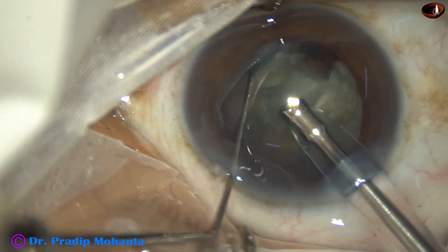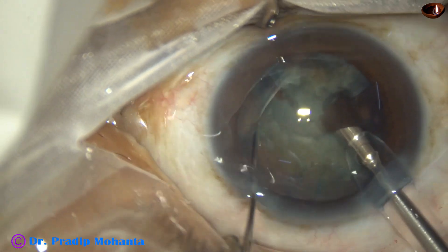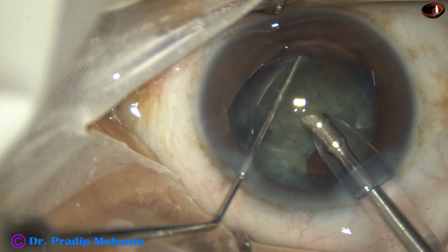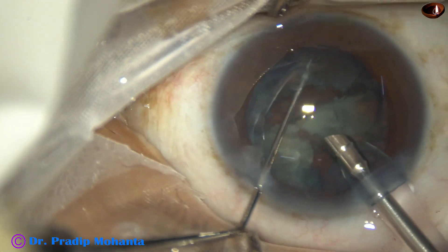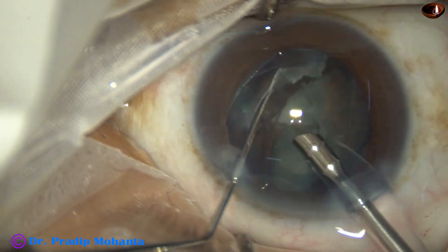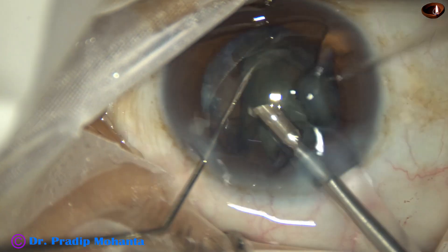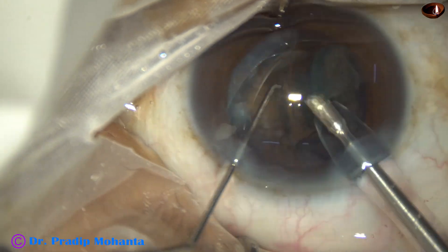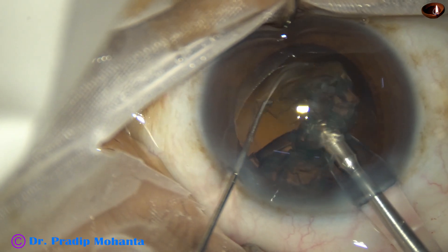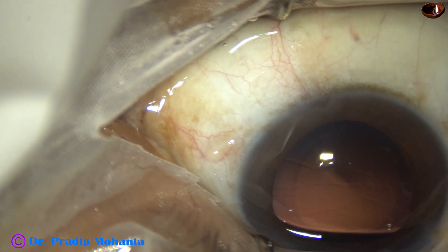After making some fragments, since this is a soft cataract, I emulsified the piece. But I recommend for beginner surgeons that you chop all the fragments first, and then start emulsifying, pulling each nuclear piece at the center of the anterior chamber in the iris plane. This is the last nuclear piece, and these are the epinuclear shells. The cortex has almost come out, but a little bit of cortex remains.